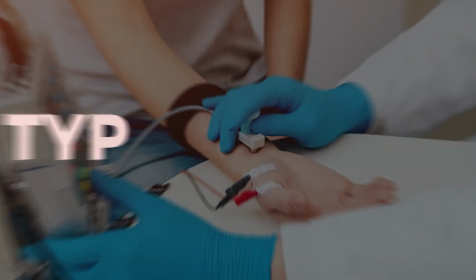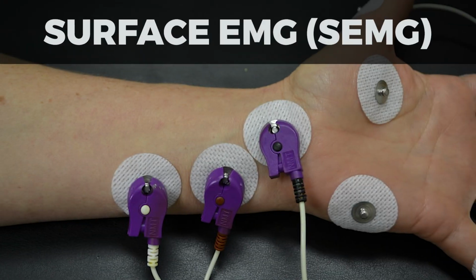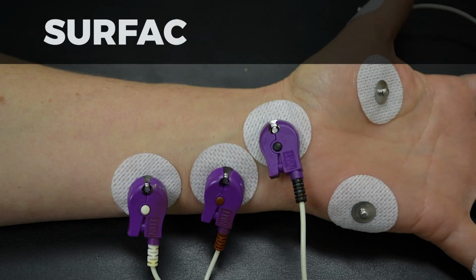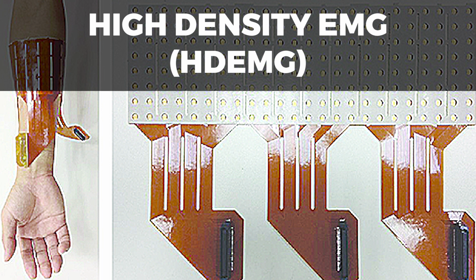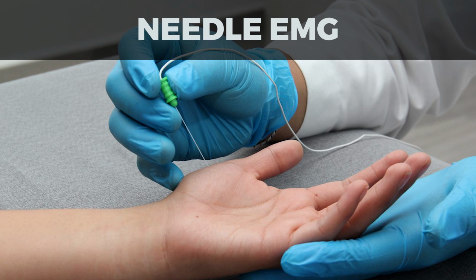Now, let us focus on the different types of EMG. There are several types of EMG. The most important ones are surface EMG, abbreviated as SEMG, high density EMG, abbreviated as HDEMG, and needle EMG. They differ in the placement of electrodes and the number of electrodes used, and therefore, in the data obtained. One of their differences is the scope of the technique. Figure C illustrates the scope of various EMG techniques.